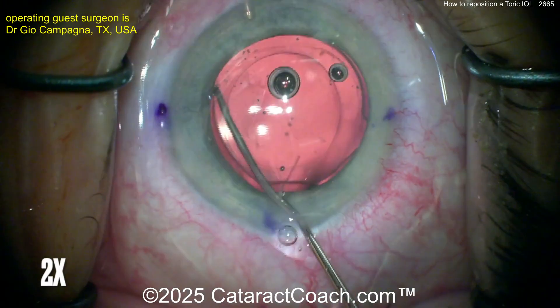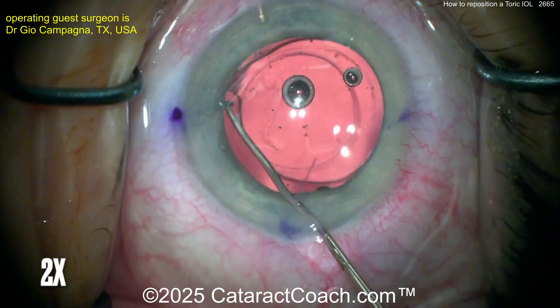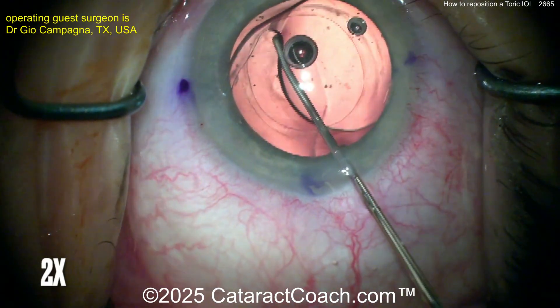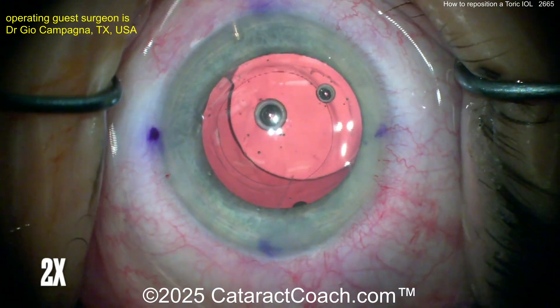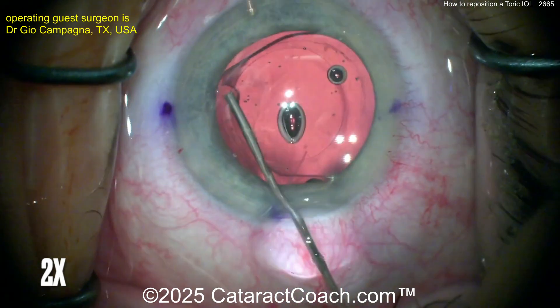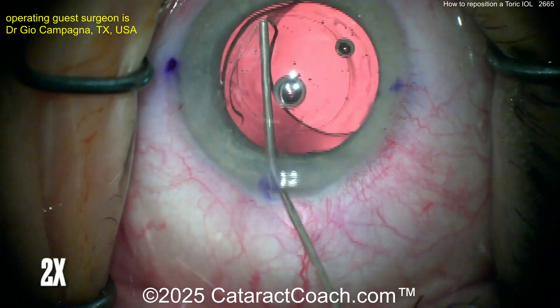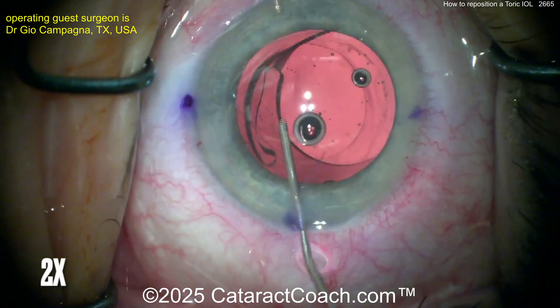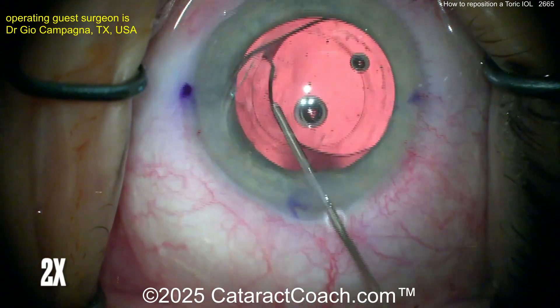Here we're going to carefully bring that lens and get it rotated up. You could get the lens completely out of the capsule bag, but that may not be necessary — you definitely have to free it up. If the haptics are stuck, this Alcon-type lens has bulbous tips on the haptics. You need to spend enough time to visco dissect and really separate the anterior leaflet of the capsule from the posterior leaflet — that's super important. Once that's done, you can free that haptic up.